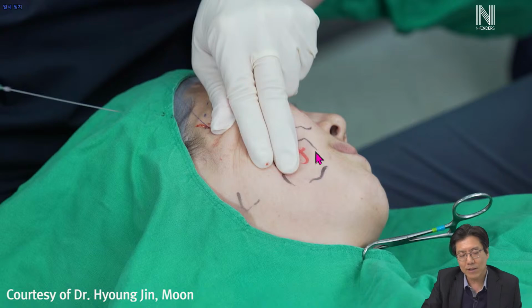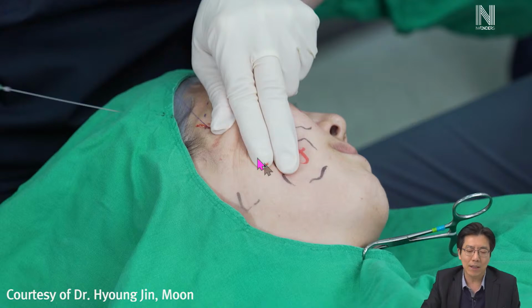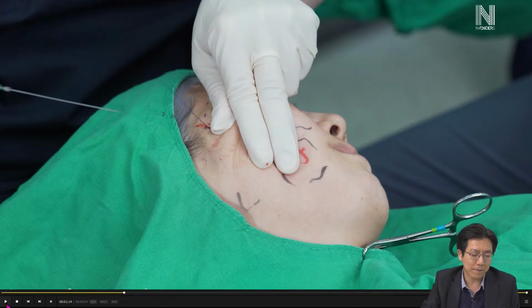Our target is just the jowl fat. So you should see my thumb. My thumb is fixed. I use the second and third fingers to lift the jowl fat only. Other fat compartments, especially the lateral fat, I fix in position with my thumb, and I lift only my target fat compartment, the jowl fat compartment.